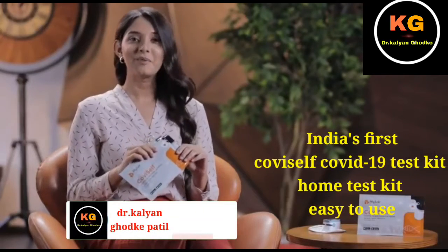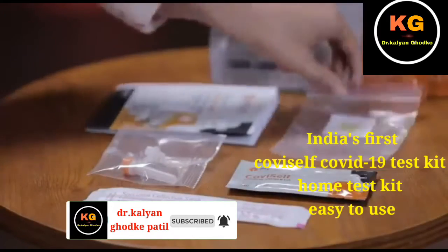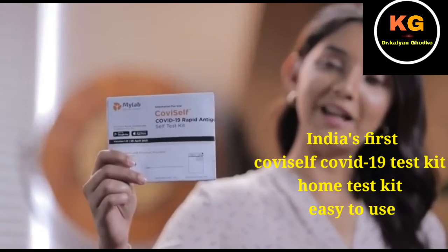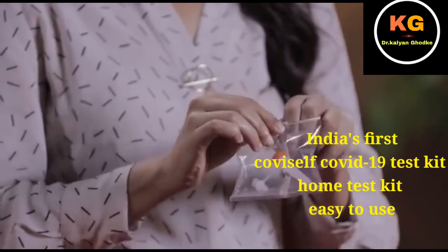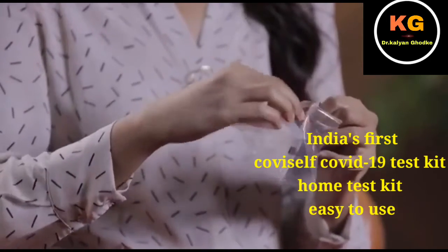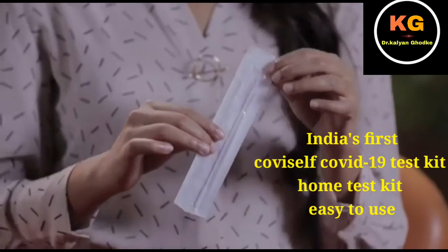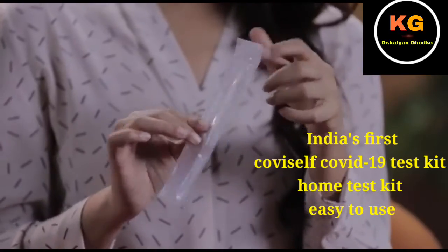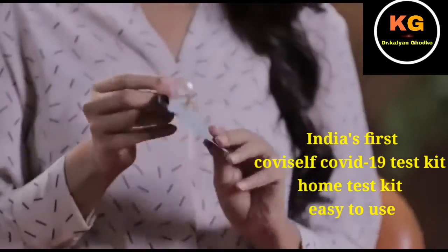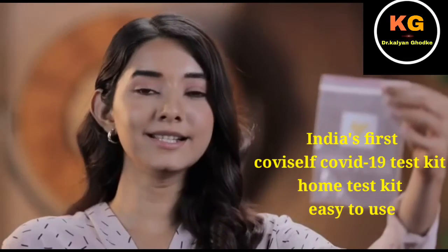Lay the contents of the kit on a table and I will walk you through them one by one. This is the instruction manual. This is a pre-filled extraction tube. This is a sterile nasal swab. As you can see, it has two sides. One is the plastic side and the other one is the paper side. One test card. This is a biohazard bag.